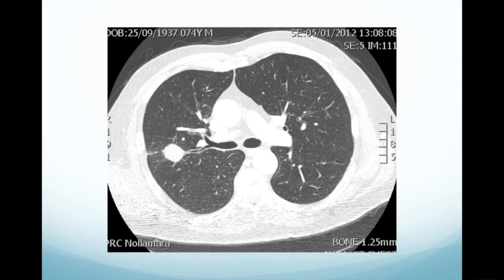Here's the CT scan demonstrating the nodule which is situated in the right upper lobe. This is at the level of the carina. This is the left main bronchus and the right main bronchus. This is heading up to the right upper lobe bronchus, and you can see the anterior segment and the posterior segment. Here you can see this nice airway sign — the posterior segment leads straight to this lesion. This measures about one and a half centimetres or 15 millimetres. It has a speculated border and looks very concerning for a lung cancer.